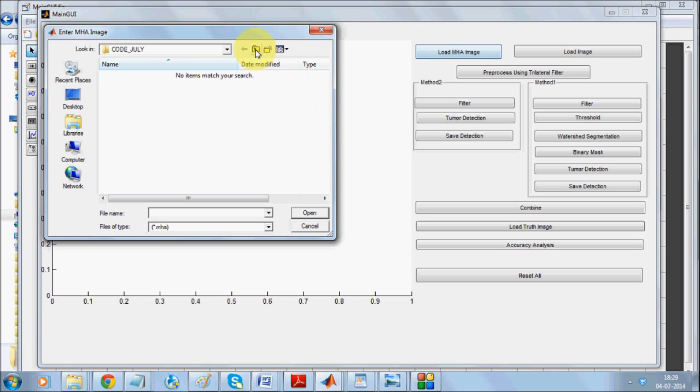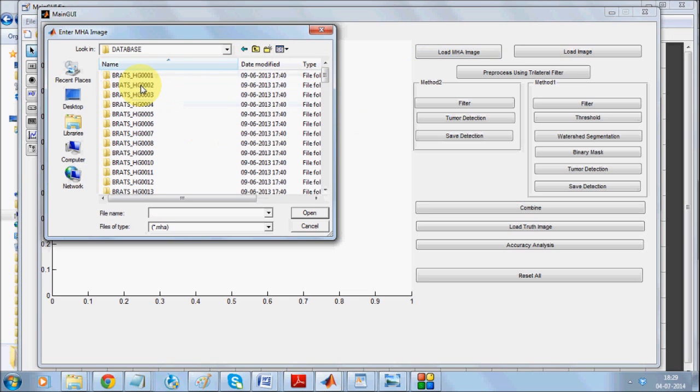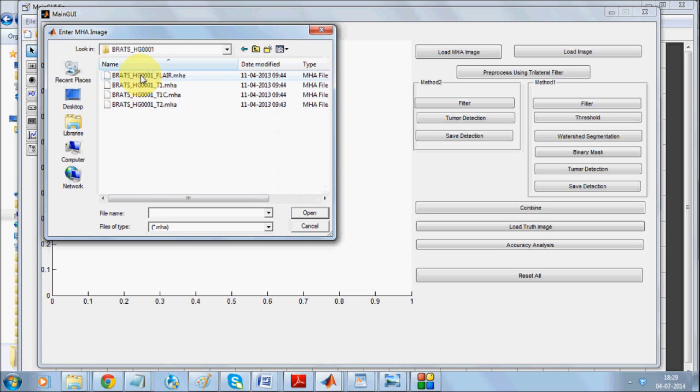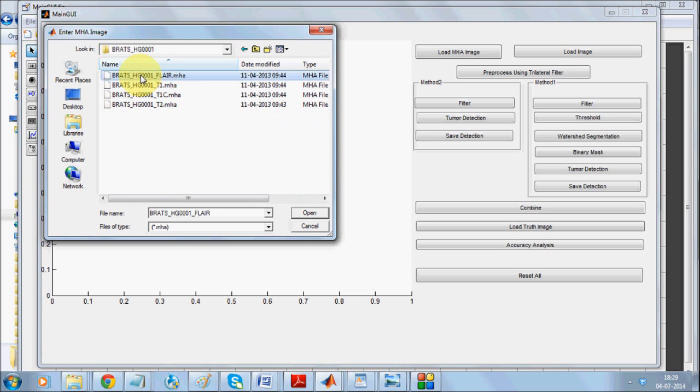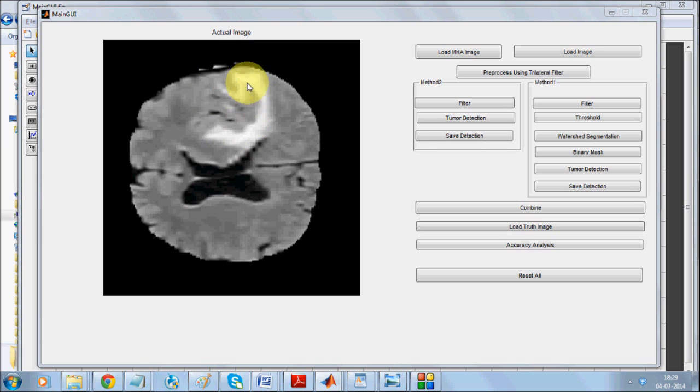I'll be loading this first image from the database. Alright, this is the actual image and this is the area where the tumor has appeared. This is a clear case but should our algorithm be able to detect it.